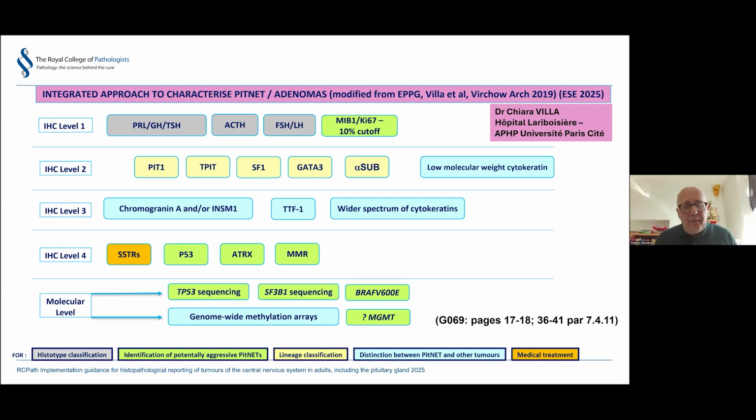Some of the stains that we put as level 4 help identify potentially aggressive tumors. P53 is losing momentum, but is still helpful in corticotrophs. Sometimes they are subclonal. So you find 10% of the tumor with strong positivity, and the rest is negative. When they recur, the positive clone becomes 50-70% and eventually becomes the predominant one. ATRX is always very helpful, with the same immunohistochemistry protocol as we use for gliomas.